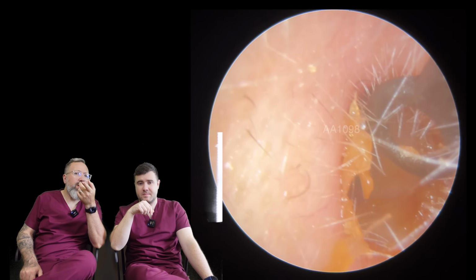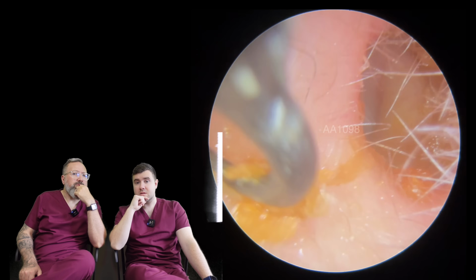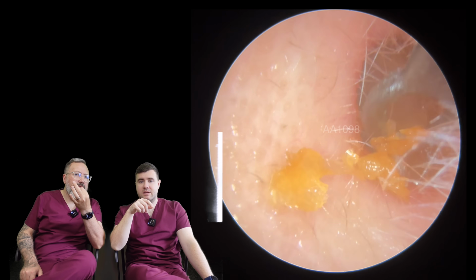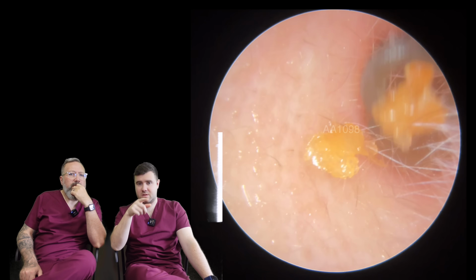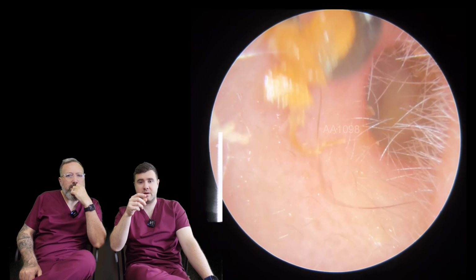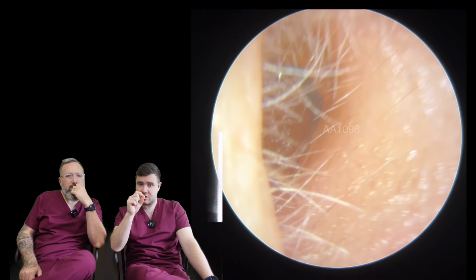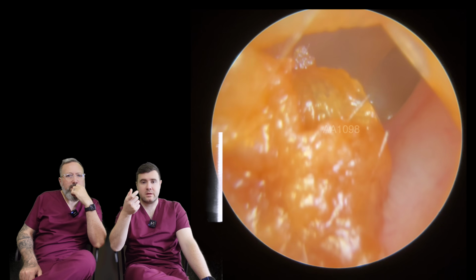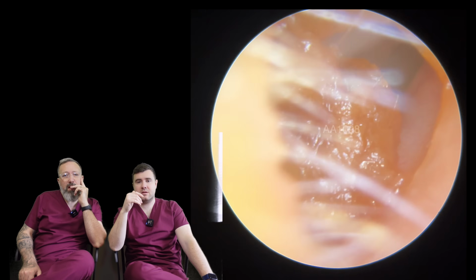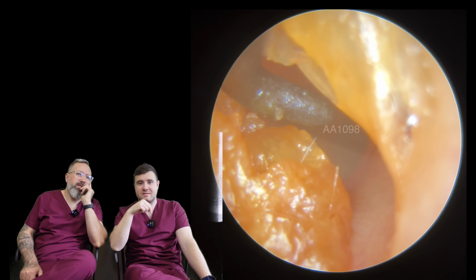How are you getting on with Neil's tools as far as the Jobson horns? Because I know you've almost become a lover of those big, thick Jobsons. I quite like the Jobson horn, to be honest. They're all really good, to be fair. I'm getting on really well with them. I like the hook as well, the smaller right hook than a St. Bart's hook. It's like if a Rosen inserter and a St. Bart's hook had a baby, this is what it would look like.